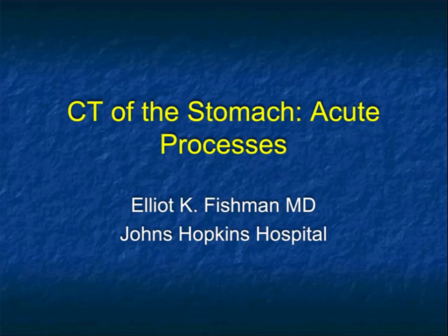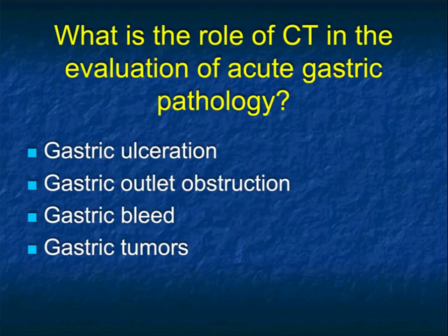This is going to be a talk I've just put together over the last couple weeks that I'm excited about. It's looking at the stomach, looking at acute processes. I've given a number of talks on CTisus in the stomach. You can look them up. They're terrific talks. Most of them tend to focus on malignancies, looking at adenocarcinoma or lymphoma or GIST tumors or metastasis. We talk about staging and recurrence. But this talk will have a little bit of malignancy, but really I'm talking about acute processes.